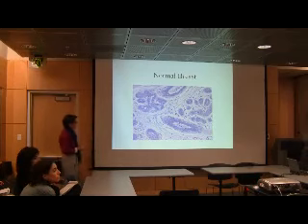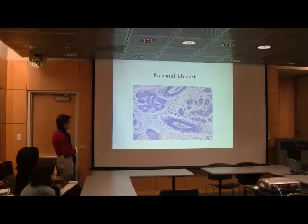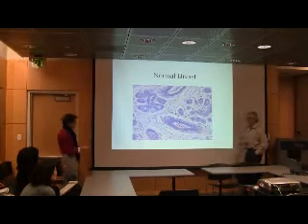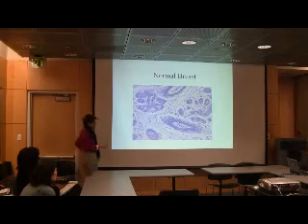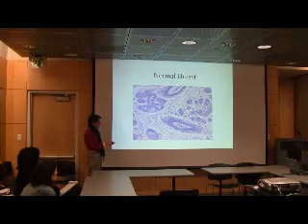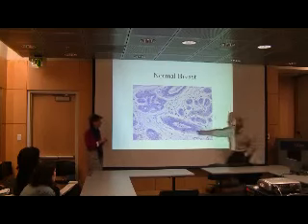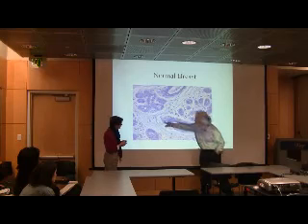Sorry, what are the cells inside the duct? Inside the duct, like right in here. Okay, so let's take this one. There are two main layers of cells. There's this inner layer of cells here. Those are the epithelial cells. And there's an outer layer of cells that are a little bit more elongated. Those are the myoepithelial cells. Can you see that? Like here, here, here.